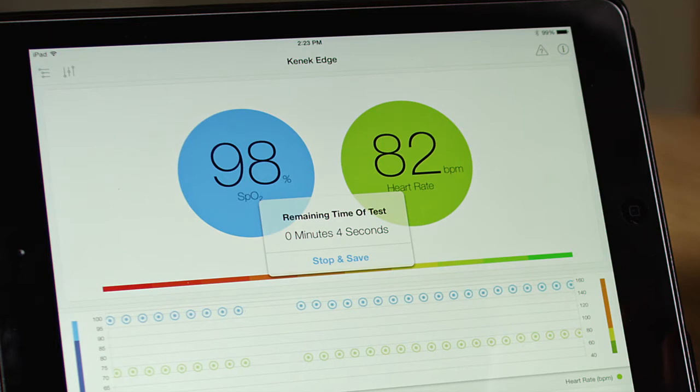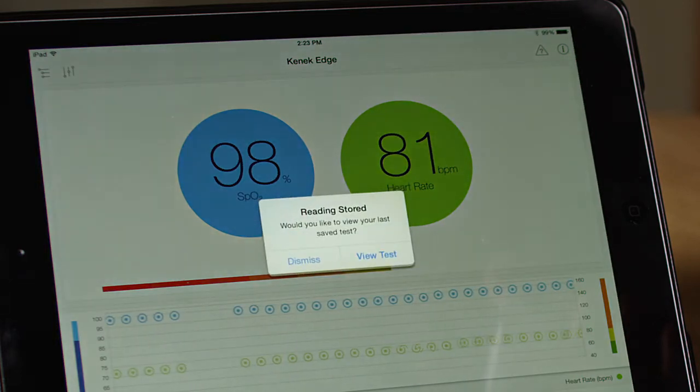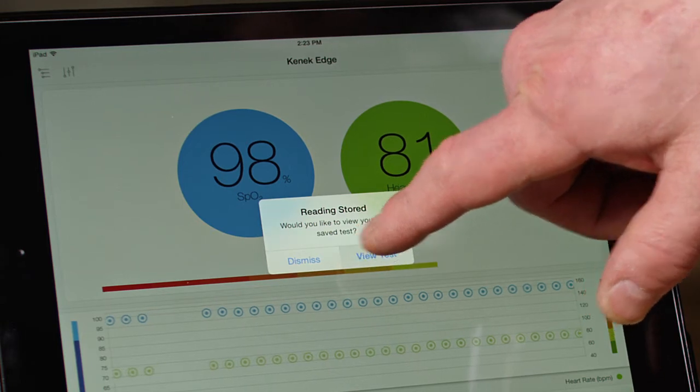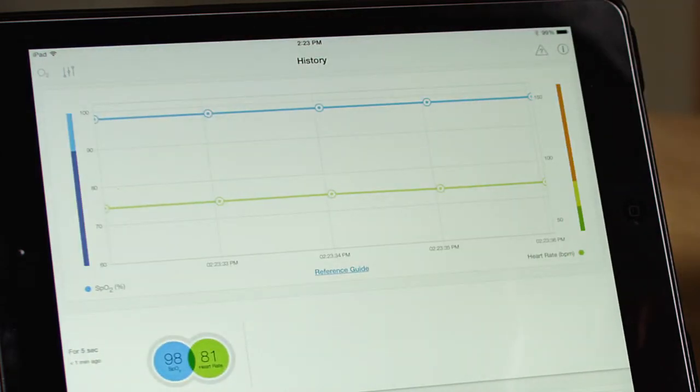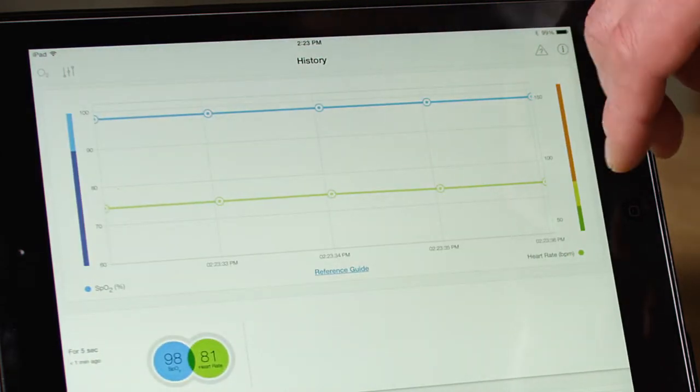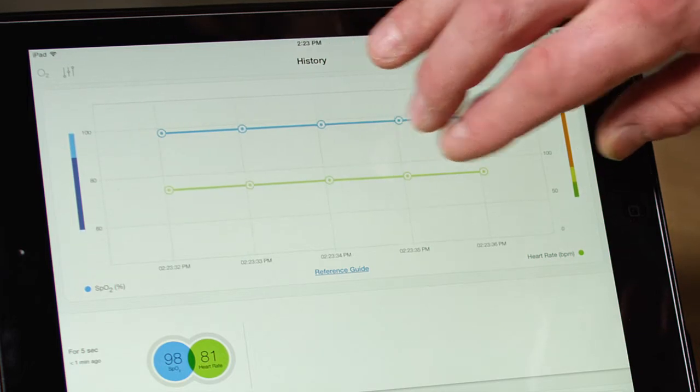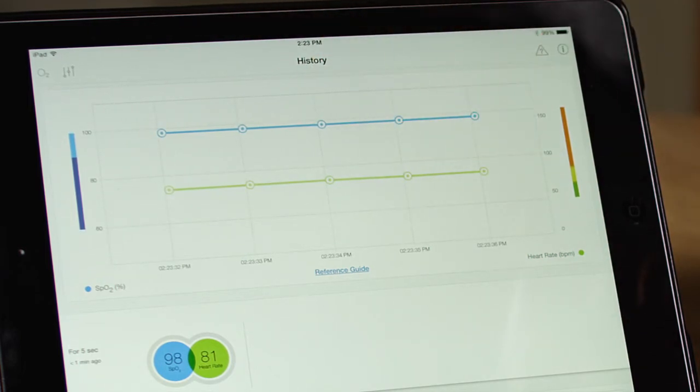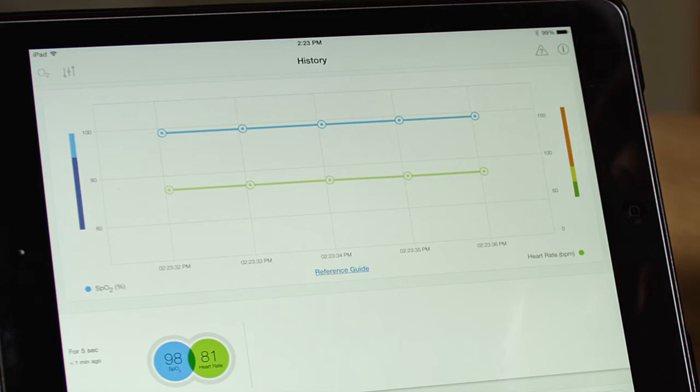And it will, in this case, capture for about 5 seconds. And then I can go view that data. So here we have the data for the 5 seconds that the test ran. And I can collect many of these different data sets over time. In this way, I can monitor my SpO2 and heart rate values from instance to instance.